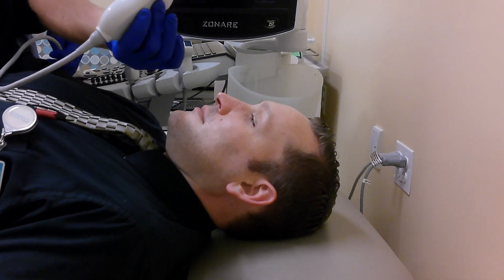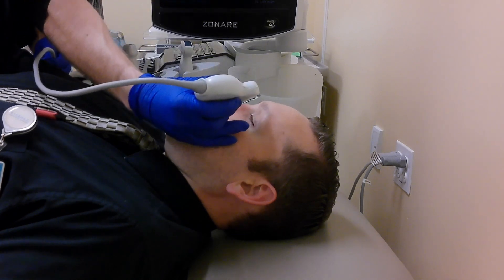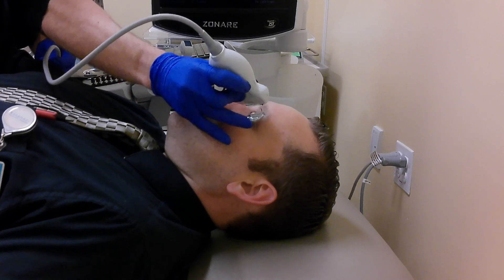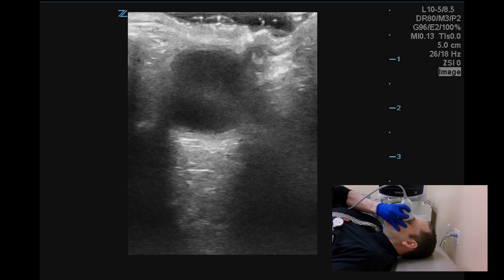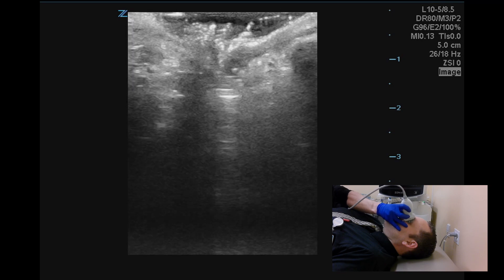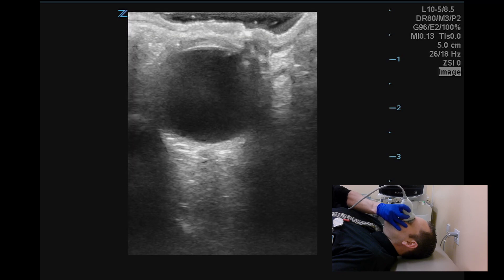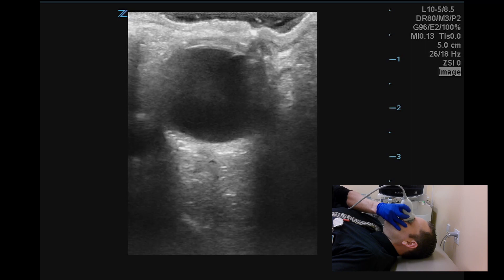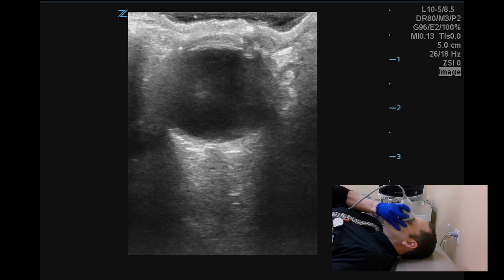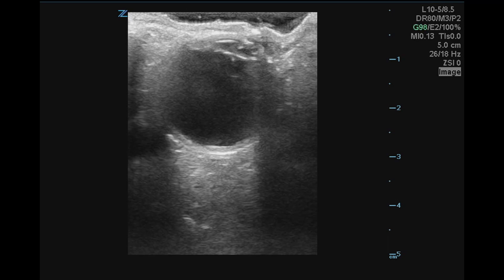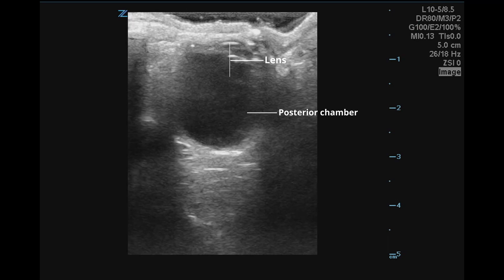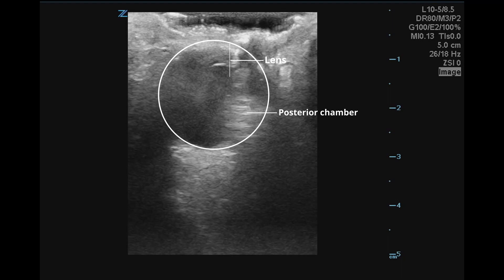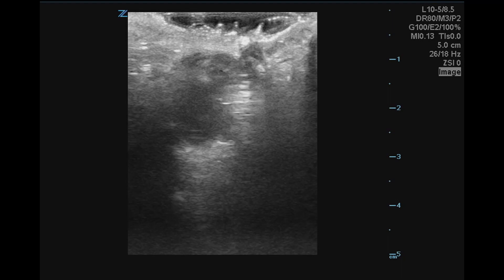Starting our exam, we've instructed the patient to look directly ahead and close his eyes. Using our linear probe, we can apply some gel to the eyelid and start scanning. On initial assessment, we're able to visualize the eye as an anechoic sphere in the center of the screen, with noticeable posterior acoustic enhancement. We've instructed our patient to look up and down, as well as right and left. While scanning, pay attention to the lens, posterior chamber, and outer margins of the globe. In this case, our patient has a perfectly normal eye with full range of motion.